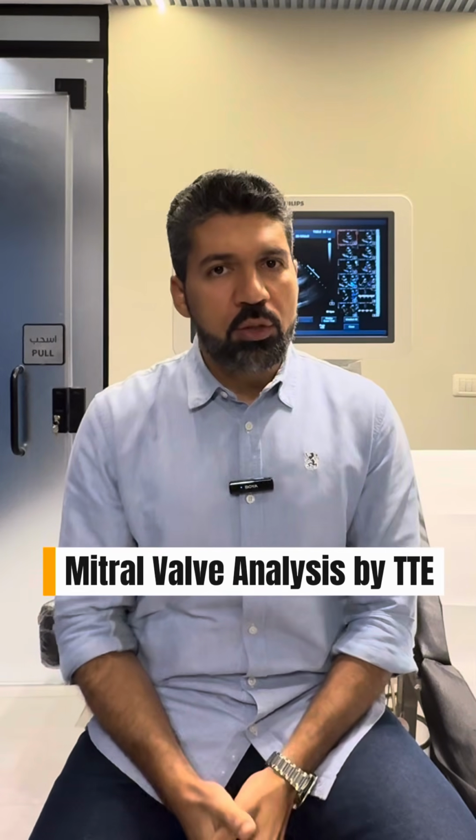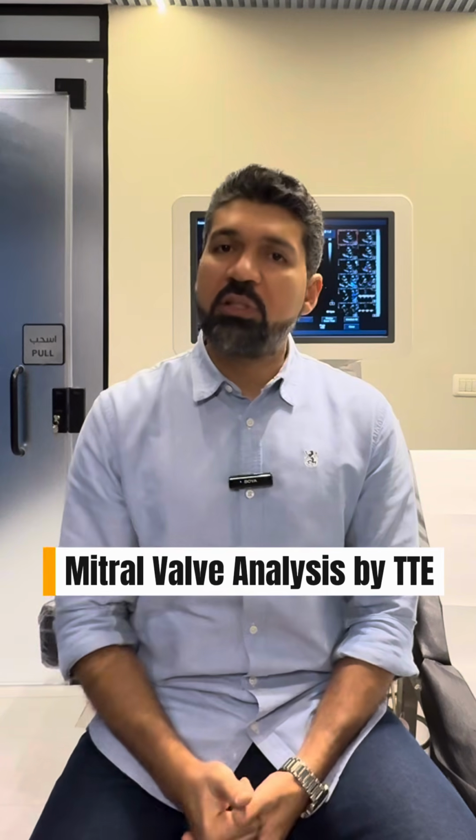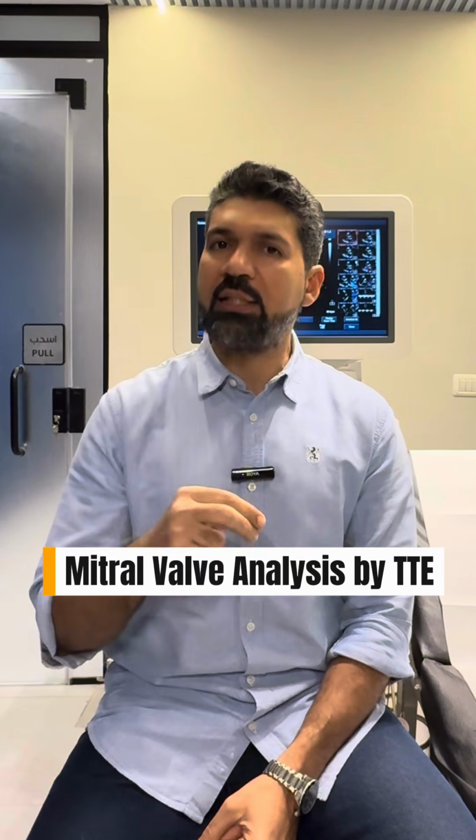The mitral valve anatomy. If you are using trans-thoracic echo, you can still do a full analysis of the mitral valve anatomy in order to understand if the patient has mitral regurgitation, from where exactly this regurgitation is coming. This is by deciding what are the scallops that are leaking and what are the scallops that, even if they are prolapsing or tented, they are not leaking.